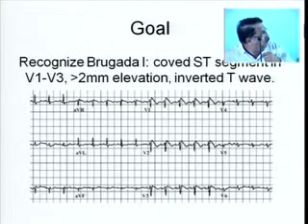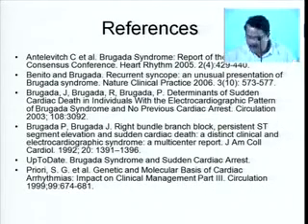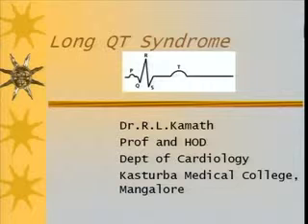Now, that's only as far as Brugada is concerned. Let me go to the next topic, long QT. Here also I'll give a short case history.